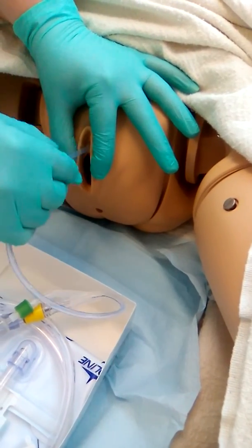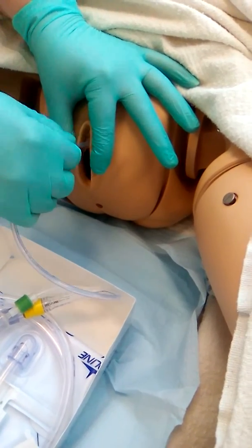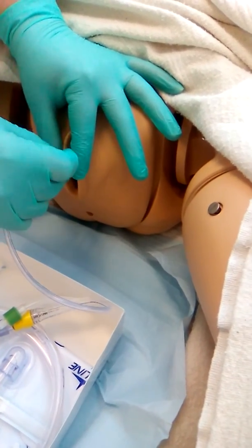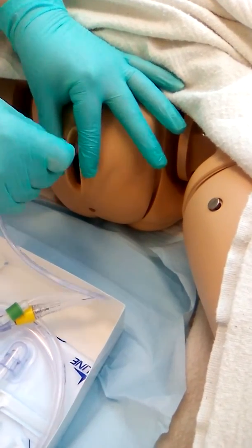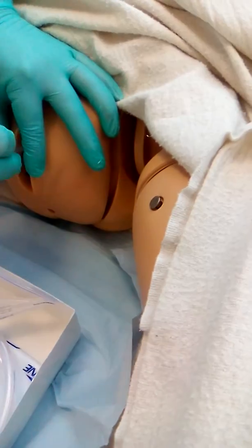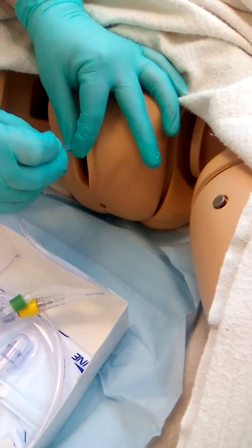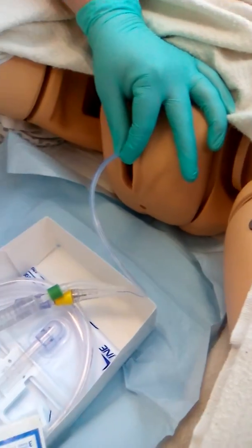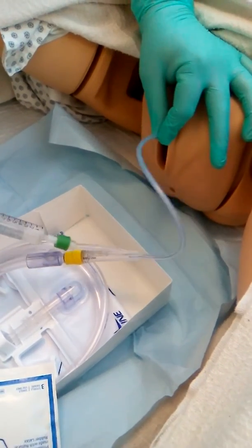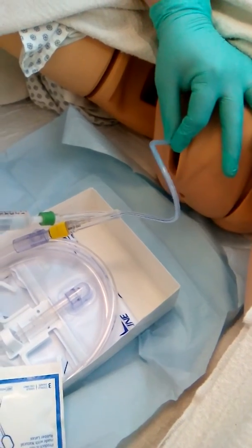Once urine appears, I will insert it 1 to 2 inches further, ensuring that I am not touching the urinary meatus with my fingers. I will then grasp the catheter. I will insert the 10 milliliters of sterile water into my balloon.